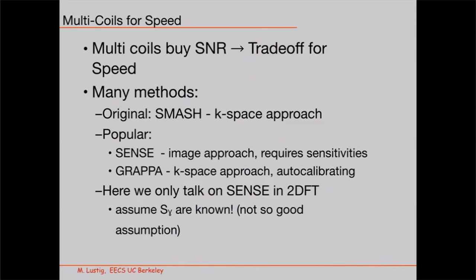Now, there are a lot of methods that people have developed, with names often corresponding to alcoholic beverages. Except SMASH and SENSE, which were early. When GRAPPA came, after that, all the methods have been kind of named after alcoholic beverages. So caipirinha, and I don't know, there are tons of them.